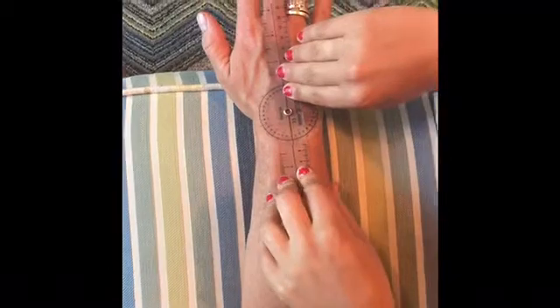We're going to be measuring wrist extension. Typical range of motion is 0 to 60 degrees. Once again, the medial aspect of the ulnar styloid process is going to be the axis, and the stable arm is going to be midline to the ulna. The moving arm is midline of the fifth metacarpal. So go ahead and extend your wrist. 60 degrees exactly.